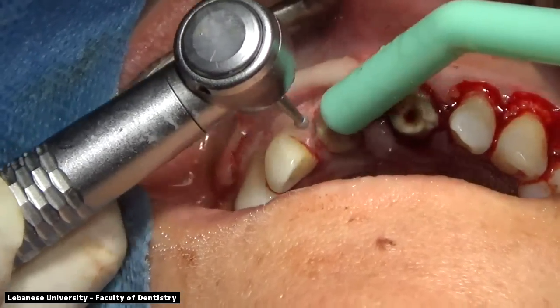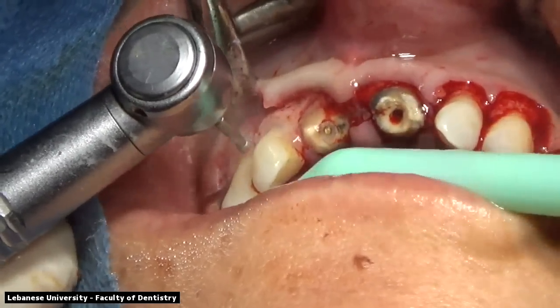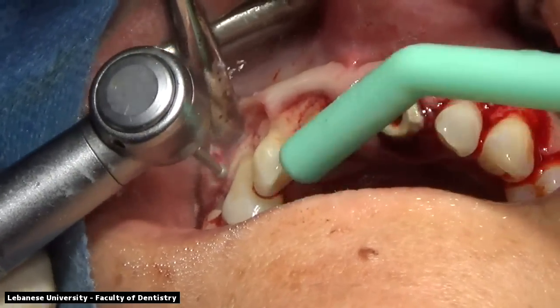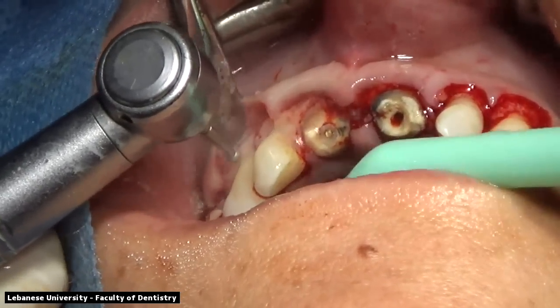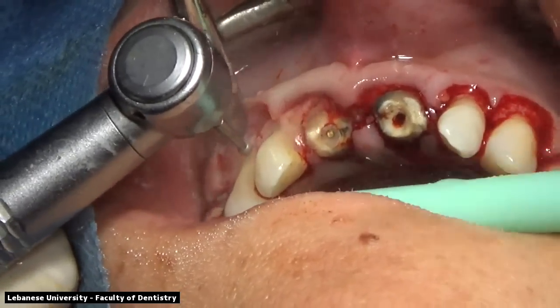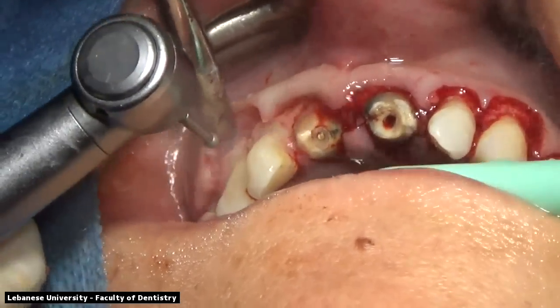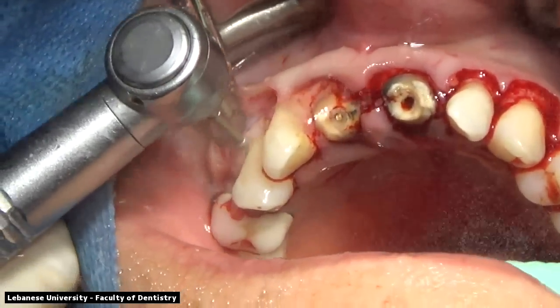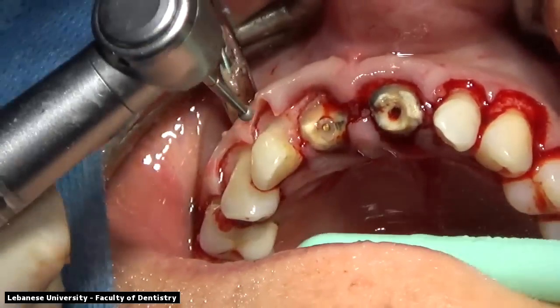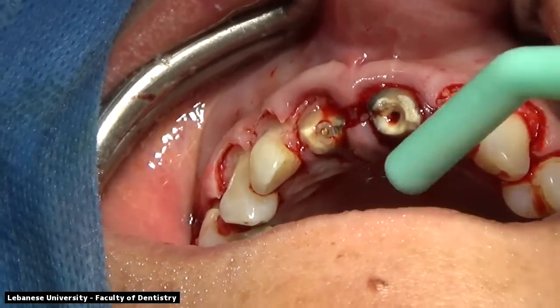After the ostectomy is done with the round burr, we will do some osteoplasty, which will adjust the shape of the bone, creating some scalloping and a more harmonious appearance of the bone so that the soft tissue can follow the bone appearance and the bone architecture. The crown lengthening procedure is done prior to the implant placement so that we do not keep the implants exposed in the oral cavity while we perform the crown lengthening on the right and the left sides.